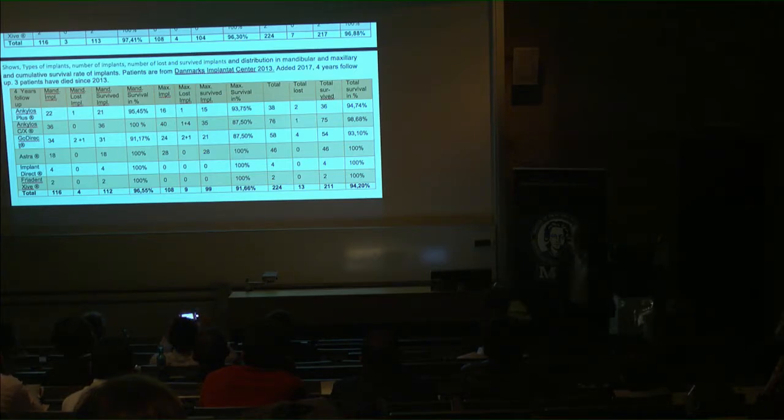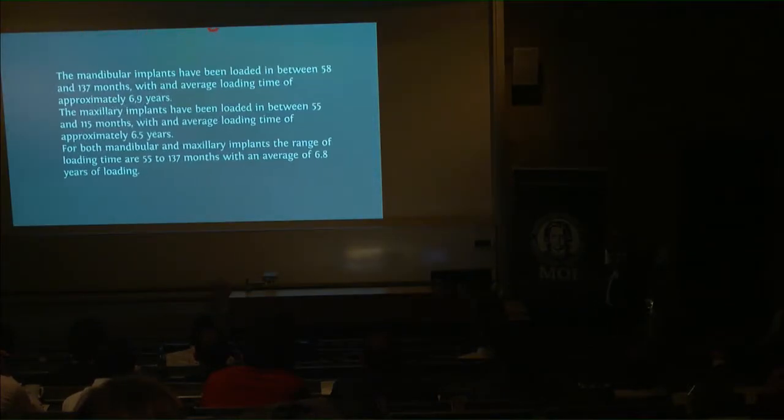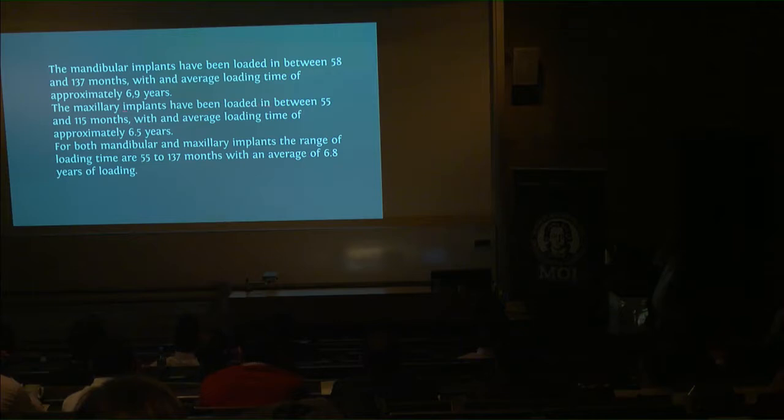Some of them didn't do very well. You see, 3 patients have died since 2013. I lost an additional 1 implant in the lower, so we're down to 96.55%. Unfortunately, I lost 5 in the maxilla, so we're down to 99 implants and a survival rate of 91.66%. That gives us in the maxilla, which is the most interesting, an average loading time of 6.5 years.